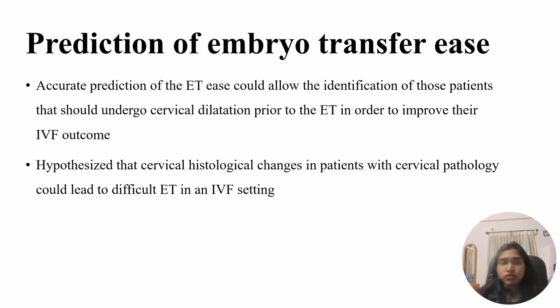Next, if we come to the cervix, it helps in the prediction of embryo transfer ease. So we will know beforehand, we can make out whether that case is going to be an easy embryo transfer or a difficult embryo transfer.